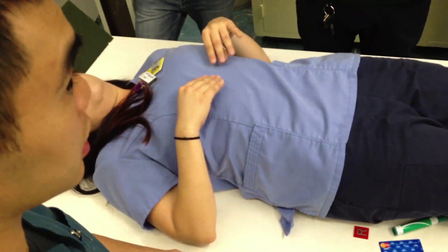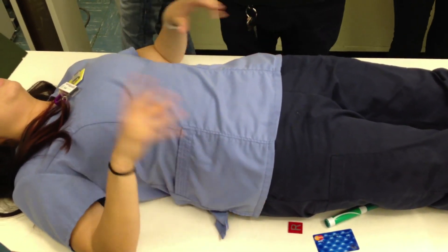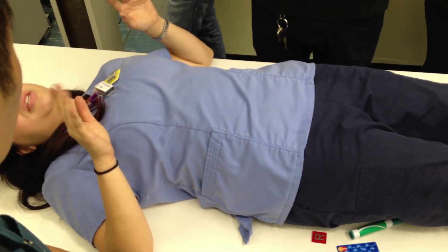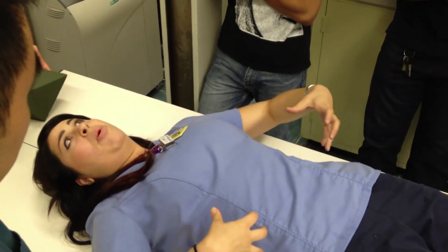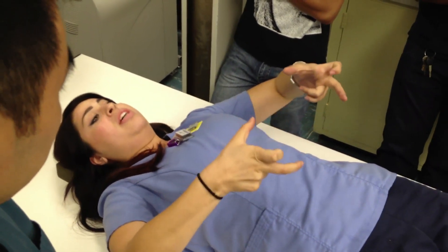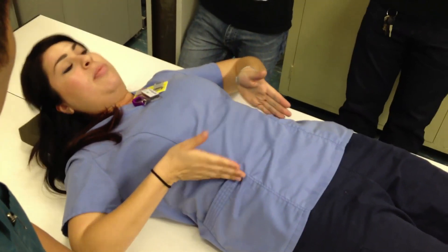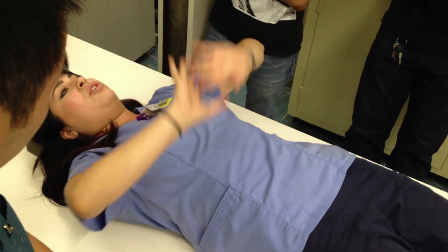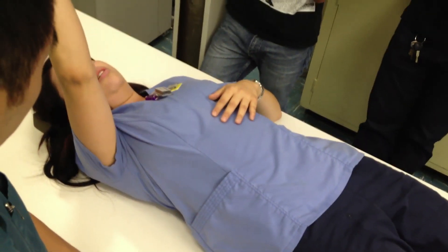For pelvis, just open the collimation all the way — that may be as much as your collimation opens anyway. Also make sure you check your SID. Sometimes if your SID isn't high enough, you may think you have a smaller area of collimation and want to open it more, but it's already open enough. If the patient is thick or tall and you're closer to them, the light field will look smaller than it actually is at the correct SID. So just keep an eye on your field size and make sure the collimation light is on both sides, then check that she's centered.